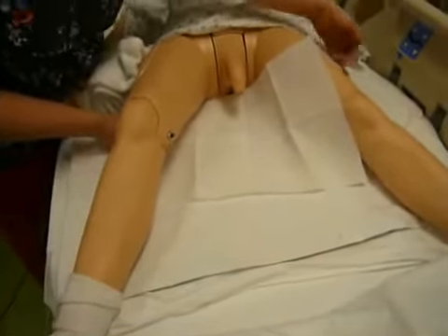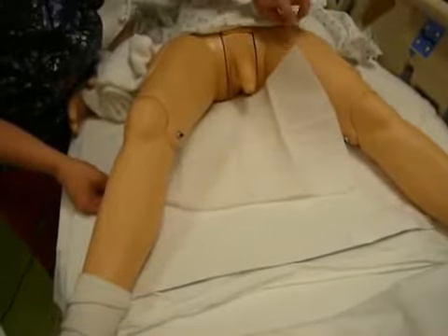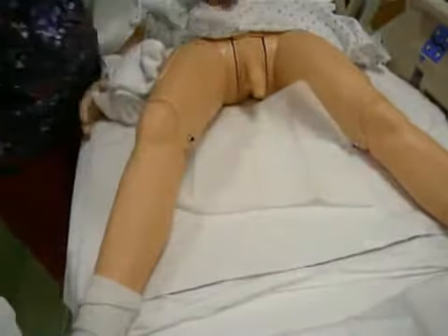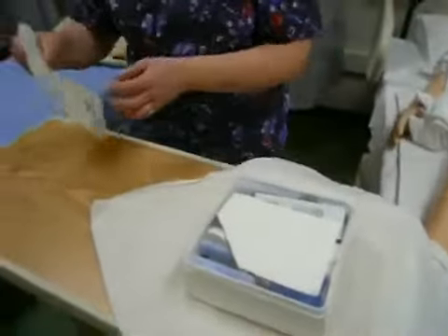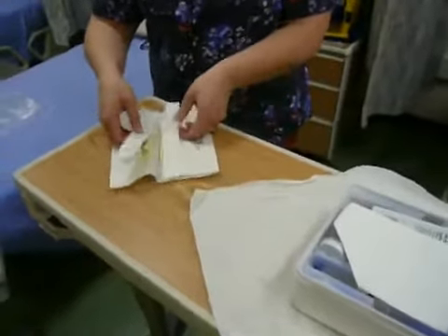Now, if I had someone on the other side of the bed, they could reach under his leg over there, but because I don't, for demonstration purposes, this is just going to fold right there. Now, I'm going to come back to my sterile field on the bedside table, and the next thing that I see in my kit is my sterile gloves, so I'm going to take those out. I'm going to step next to my kit over there, and I'm going to put on my sterile gloves.